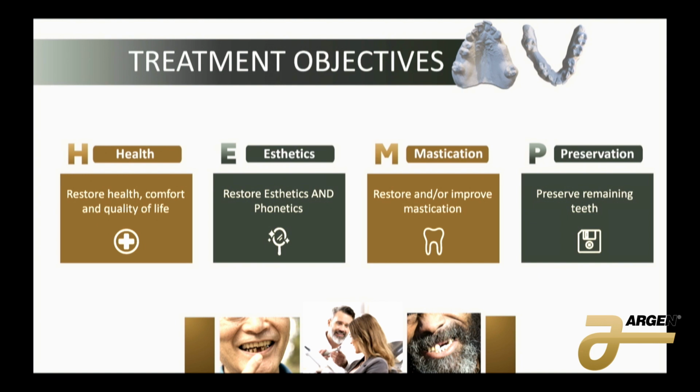Typically, if somebody needs a full denture, not every person with a full denture had all of their teeth pulled all at once. Typically they'll lose one tooth. They might get a partial. That partial might be made incorrectly. Now it's moving, it's pulling. Now it's going to move the anchor tooth that the partial sits on. And then we add to that partial in some weird, janky, welded way. Now we're putting pressure on another tooth. And slowly, over a long period of time, they're going to lose more and more teeth. They're going to get decay on these teeth, and now they're edentulous. So as we're making partials, we want to keep in mind preservation of the teeth that they already have. We don't want to make things worse for them.